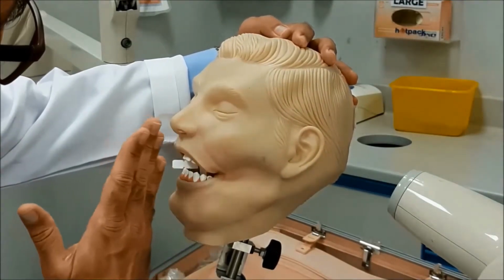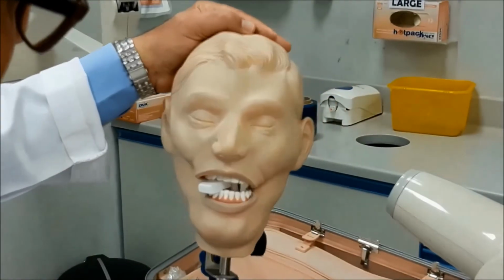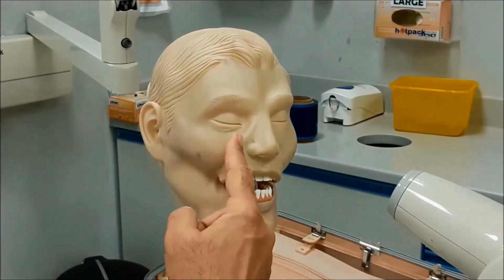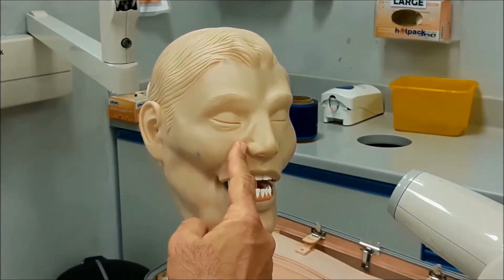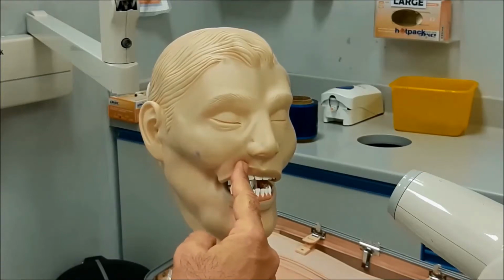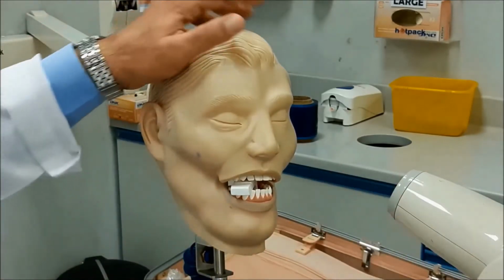Tooth, film. So again, there is a slight angle here. Where will we direct our beam? Again, the same reference point, the lateral border of the ala of the nose. Here it will fall on the upper canine. Extended down, it will fall on the lower canine. So it's the same reference point.